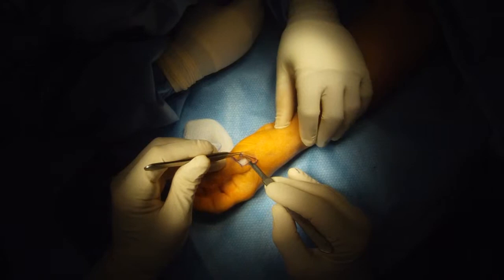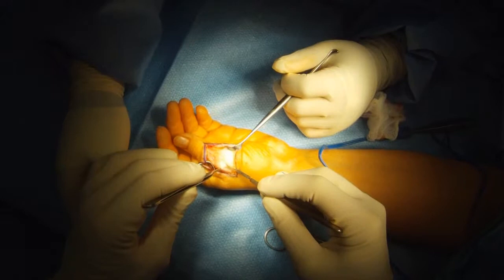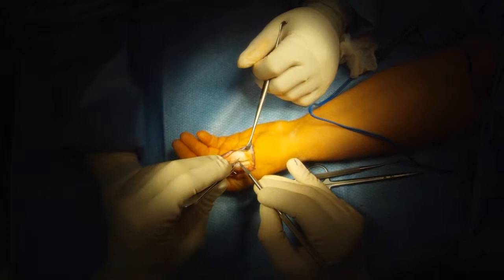The tendon is often scarred to the overlying skin, so I separate the two. I'm going to cut through the center of the tendon to expose the stiff joint, then cut out the scar from the top of the joint.